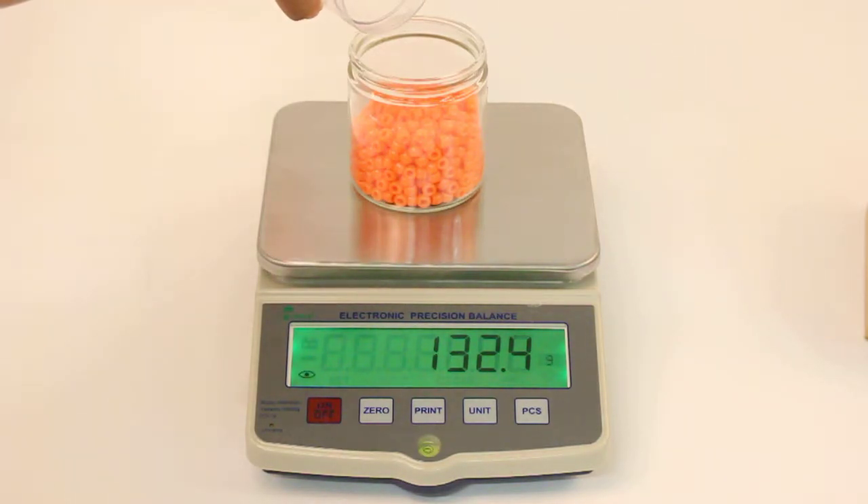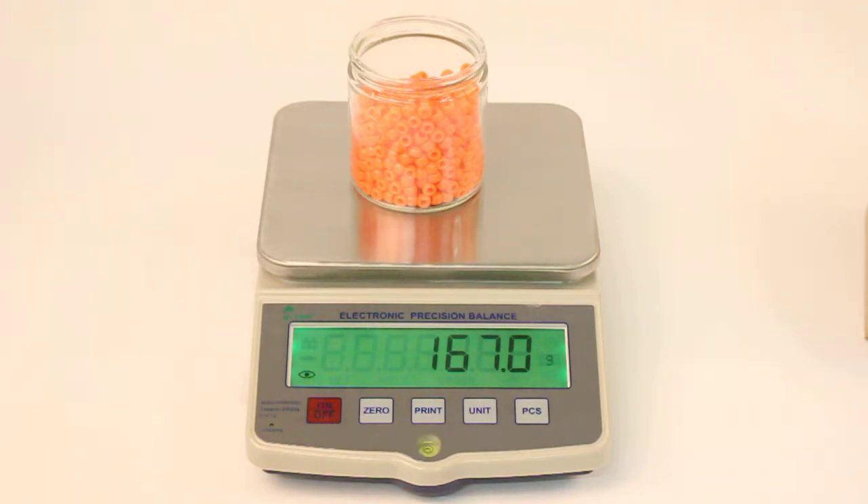It comes standard with an AC adapter and a rechargeable battery. The scale is pre-calibrated at the factory. Patent pending software allows you to calibrate the scale with any known weight in kilograms or in pounds.